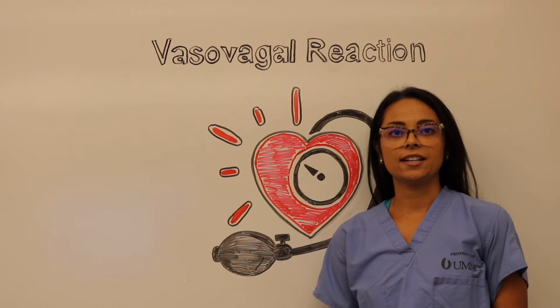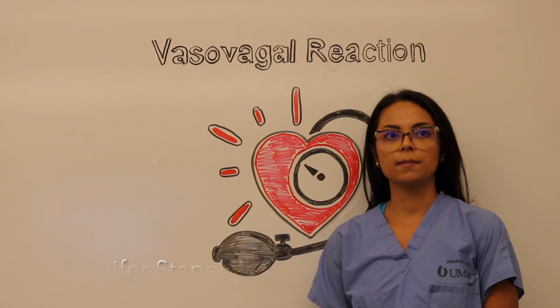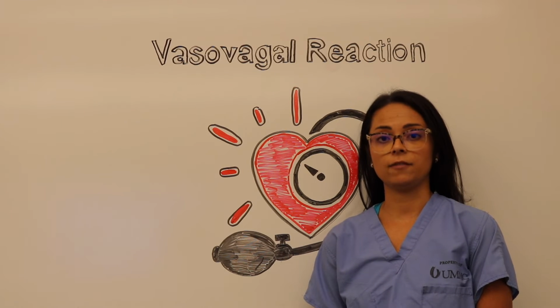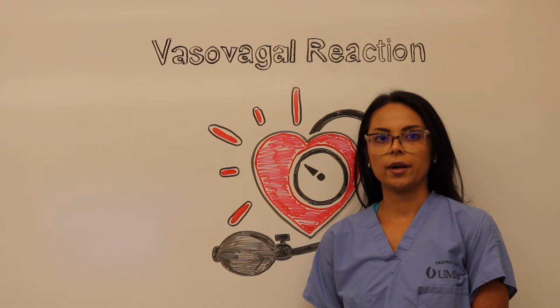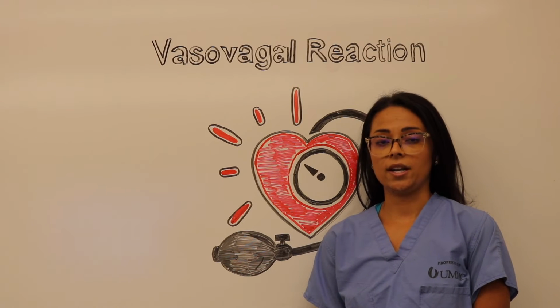Manipulation of the cervix and instrumentation of the cervical canal or uterine cavity can trigger the parasympathetic nervous system during hysteroscopy and cause a vasovagal reaction. Common sequelae include hypotension and bradycardia. Patients undergoing office-based hysteroscopy will be awake and may experience sweating, dizziness, nausea and vomiting, or loss of consciousness.